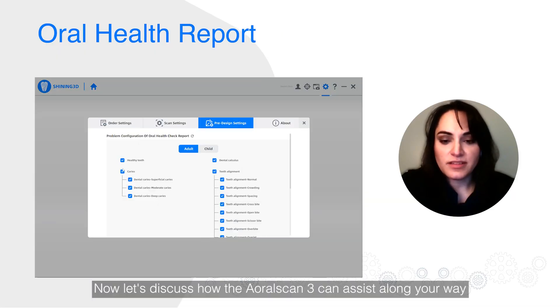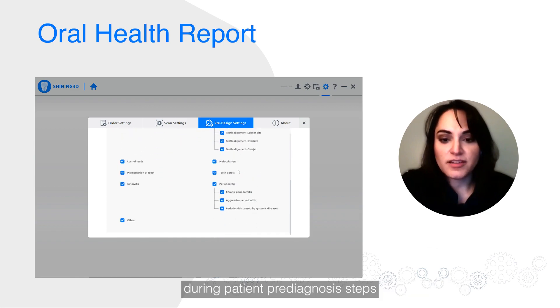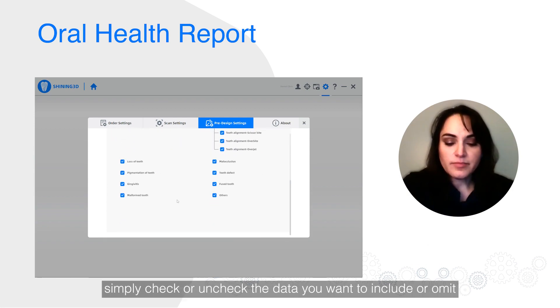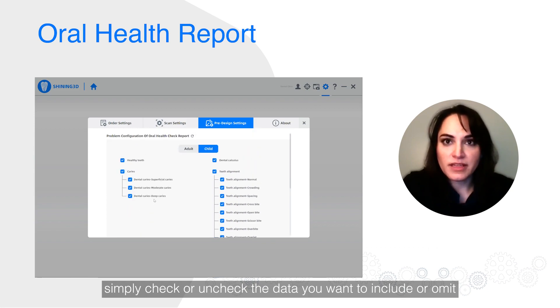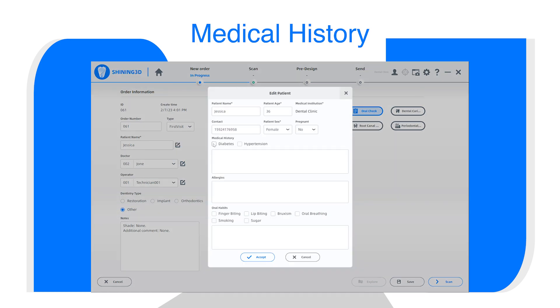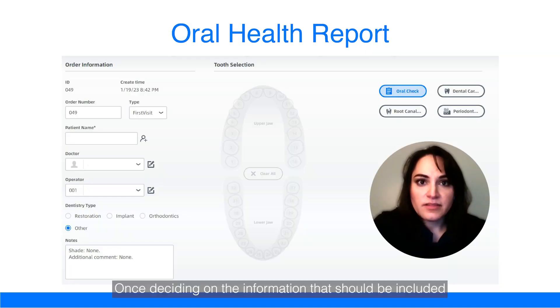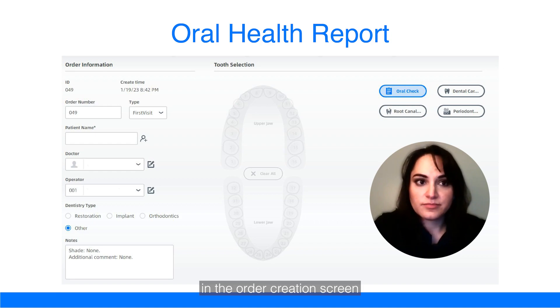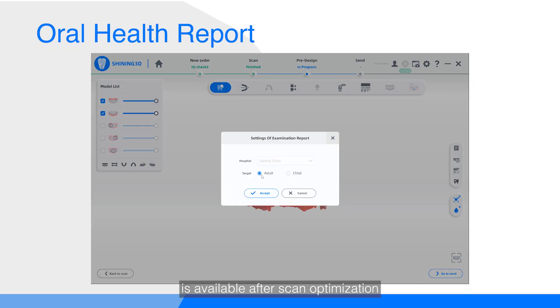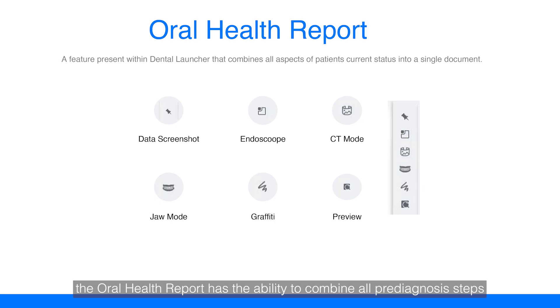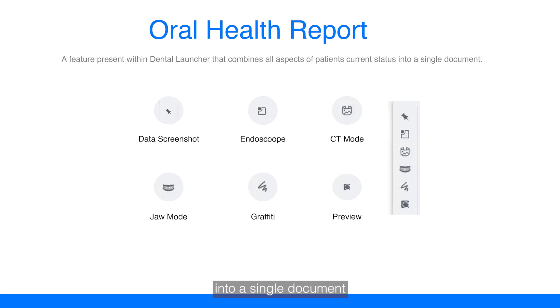Now let's discuss how the Aoralscan 3 can assist along your way during patient pre-diagnosis steps. The oral health report within the dental launcher software can be customized in the settings tab of the software. Simply check or uncheck the data you want to include or omit from the oral health report. Prior to starting the scan, you can fill in the medical history information of the patient, which can be entered within the order creation screen. Once deciding on the information that should be included in the oral health report, access the feature by selecting oral health check in the order creation screen. Alternatively, the oral health report is available after scan optimization. The oral health report has the ability to combine all pre-diagnosis steps into a single document by selecting the icons based on the information you want to highlight and customize for your patient.